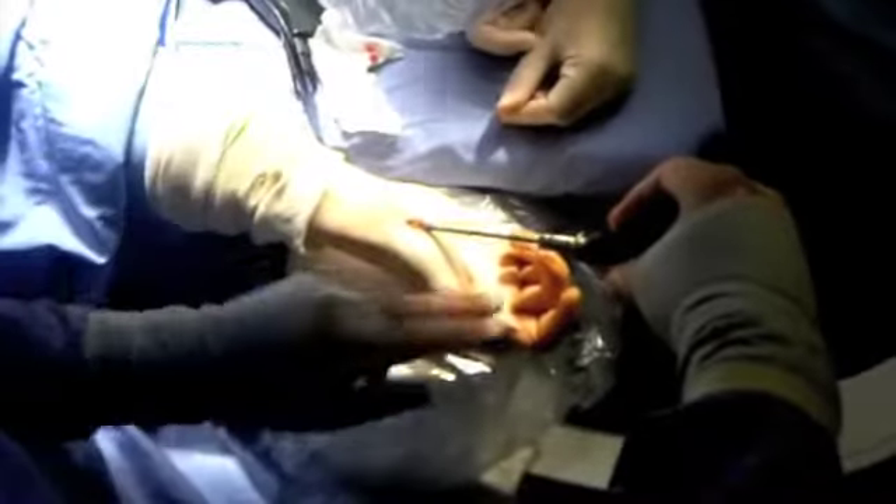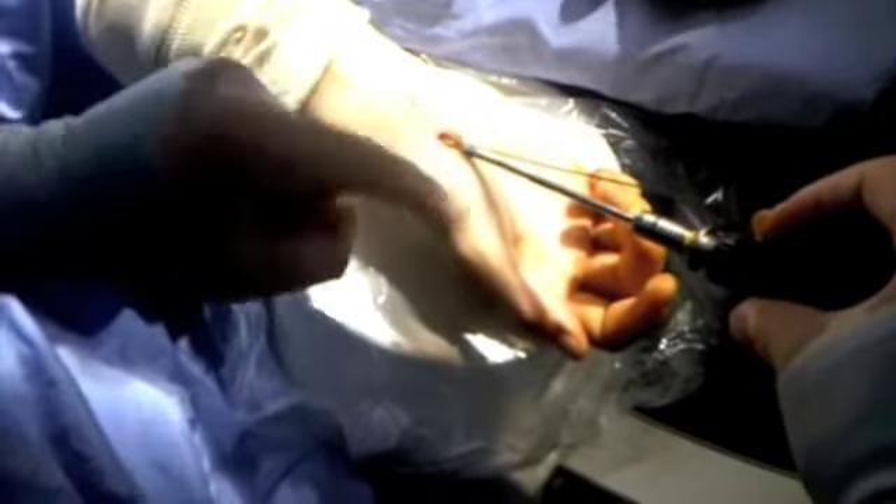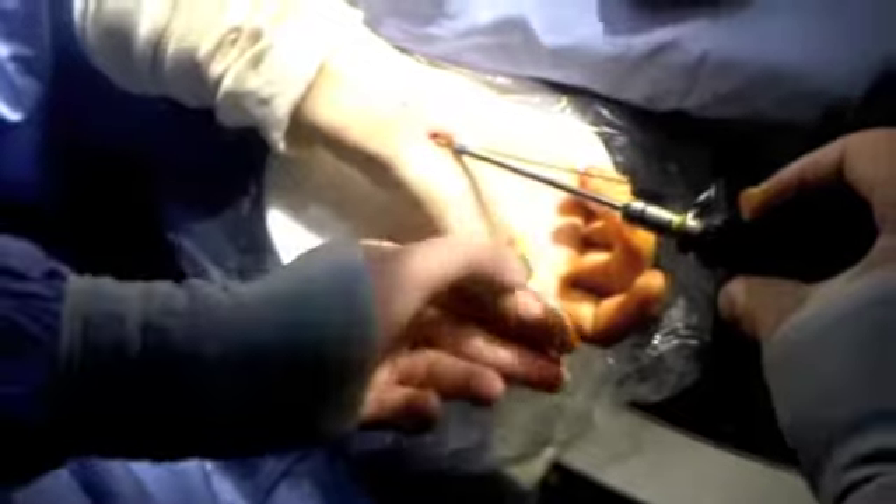This is a compression screw, but the yellow part and the blue part work independently. Now they will work in one unit because the setting is on the blue. When the setting changes to the yellow, the yellow will move independently of the blue and thereby cause compression over the fracture.